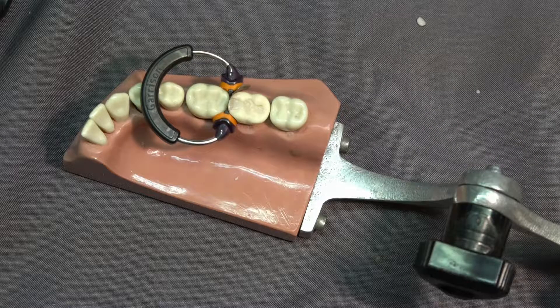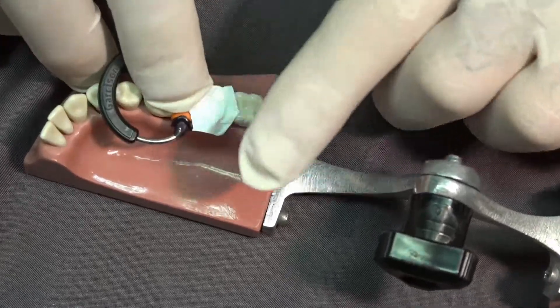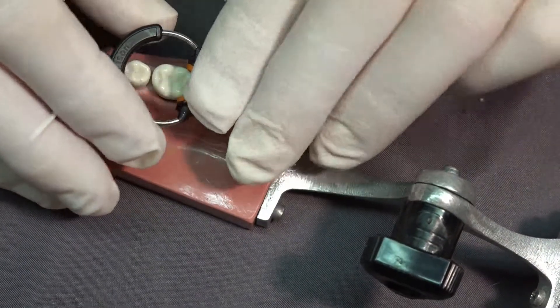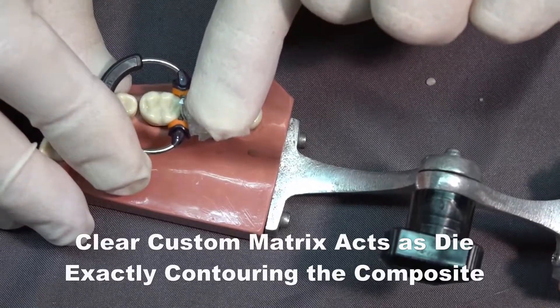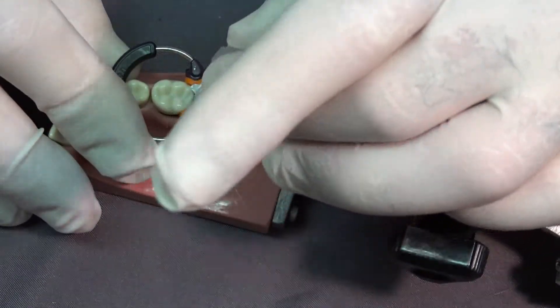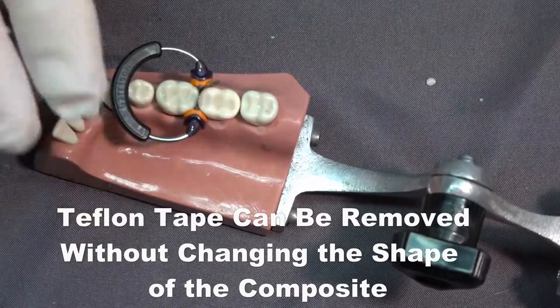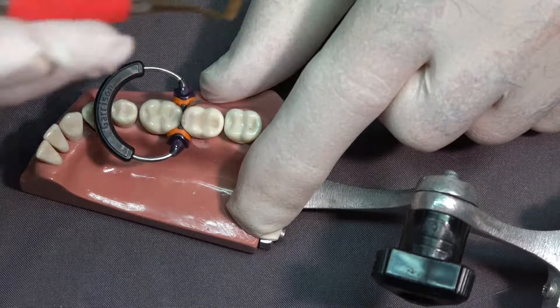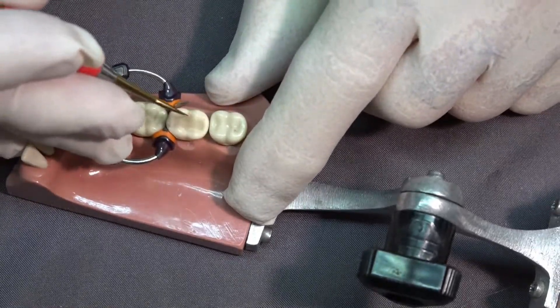I'm now going to take a piece of Teflon tape and place it over the unset composite. Then I'm going to take my custom matrix and place it back on the tooth and put pressure on it with my finger, forcing the composite into the original shape of the tooth. The Teflon tape allows me to remove the tape and then see any excess composite and remove that. I'm looking for any flash — I see very little, but there is some flash here, and I'm removing that.